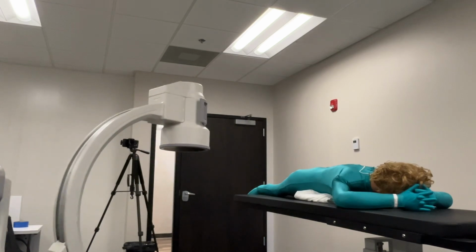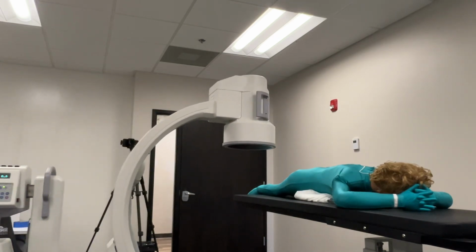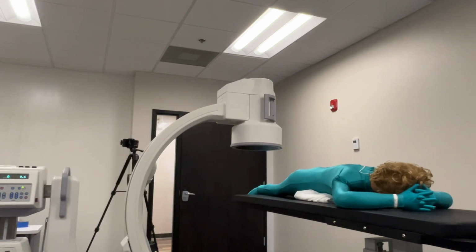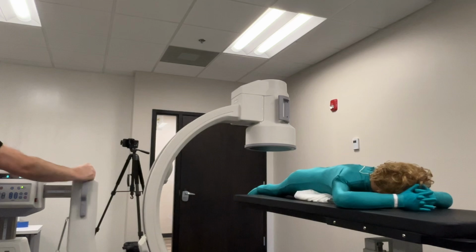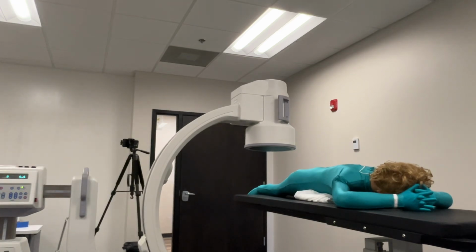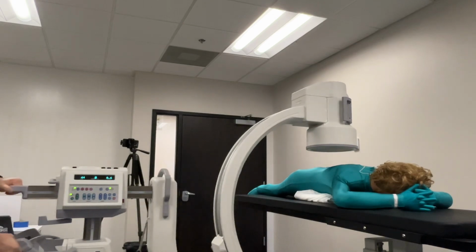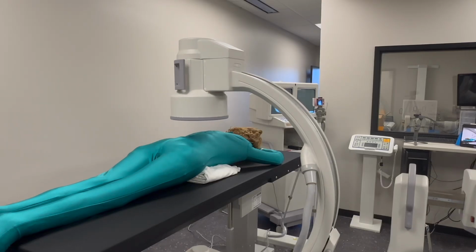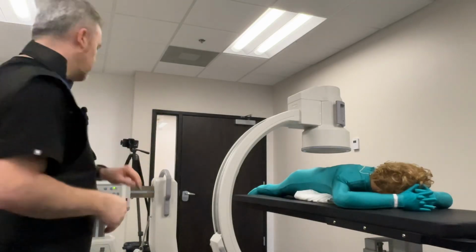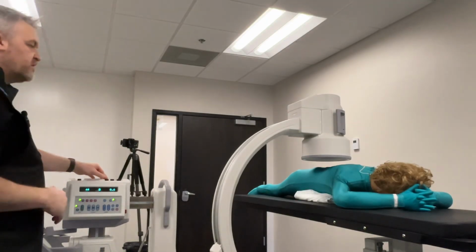So when I get ready to approach the field, I'm coming up to the level of the anatomy that I feel, and I'm perpendicular to the patient. I will then set my boom arm approximately halfway. Just gives me some room to push in and out if I misjudge my approach. So here, I'm coming in for what I hope to be centered on L3, because I want to try and get as much of the anatomy in as possible. So I'm going to drop my height to increase my field of view.